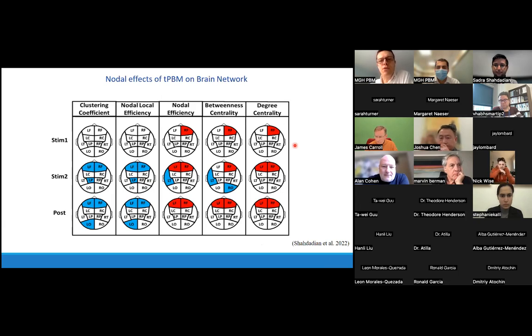And also, this is related to the connectivity. And when you looked at your alpha signal, it was much more pronounced after the second treatment, although you could tell right from the first treatment that there was an effect. I'm curious about your thoughts. A very intuitive interpretation is that this data, from a neurophysiological perspective, validates the clinical understanding that multiple sessions build on each other, at least clinically and seemingly neurophysiologically. Exactly.